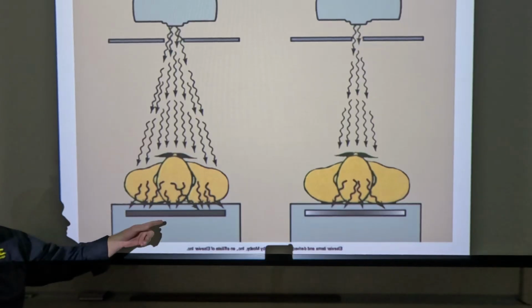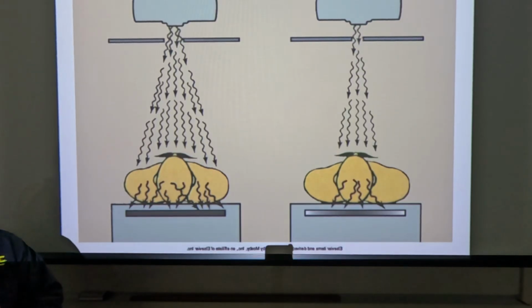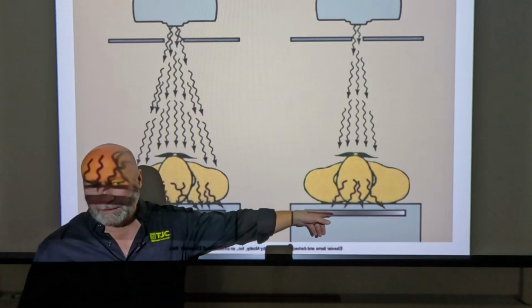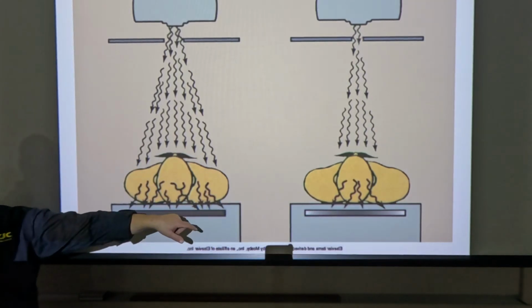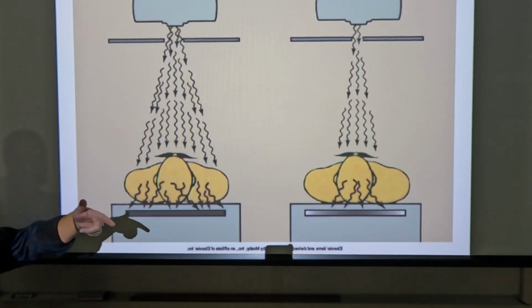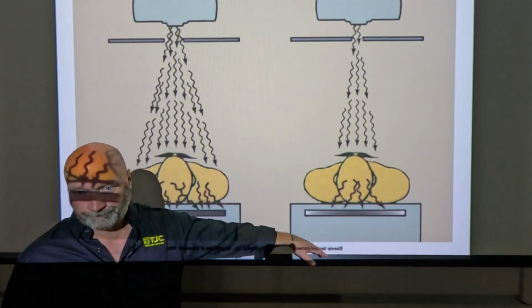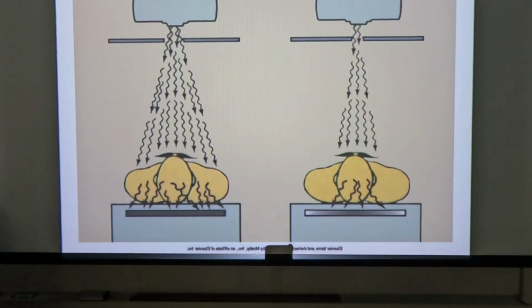The doctor said, okay, that looks good, but I want to get rid of some of that scattered radiation. I want you to collimate down just to the spine. So you go back in and you shoot to just the spine, and you don't change your exposure. You don't change kVp or mAs. What's going to happen to your image receptor exposure? They kind of show it here. It's going to decrease.